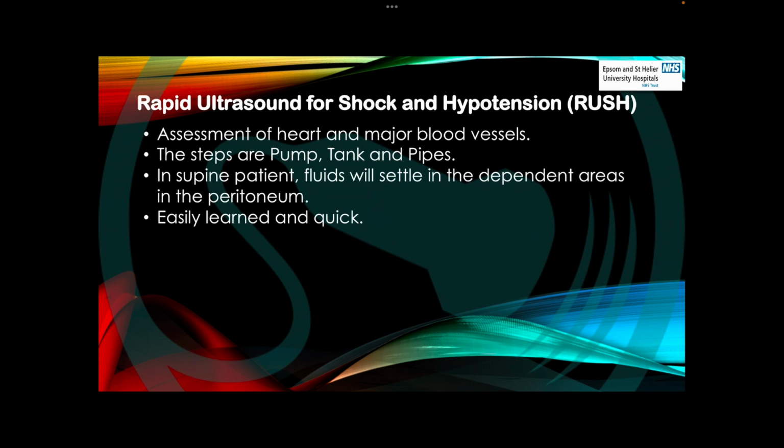it's an easily learned and quickly performed shock ultrasound protocol. The goal is to rapidly identify the causes of shock and begin early goal-directed therapy. This is not a comprehensive examination, as we said, and it should be done within 2 to 3 minutes. We need to have an idea of what is going on with the patient. Okay, and then after that, you will be able to expand the examination if you see something interesting.